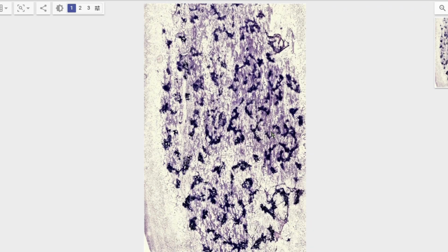This time I have a bone marrow. You can see here that this is a good quality smear, and the curved front is the thinnest part of the smear, the end of the smearing process. Being the thinner part, it is the better location to find abnormalities or to evaluate the morphology of the cells.